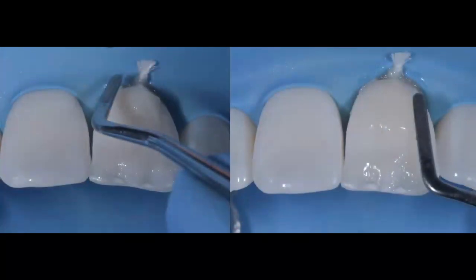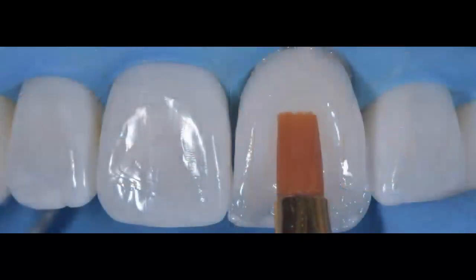Now I'm starting to build that composite, again going with that opaque composite on the cervical third. I'm literally using opaque bleach shade all throughout the restoration because she had a really high value enamel, very light teeth. She had bleached excessively, and that's something that you always have to be careful with when your patients are bleaching. Make sure that they don't bleach too much, because if it's too much, it's going to be really a tough time for you if you ever need to do a restoration. Like in this case, you're going to have a really tough time trying to match that shade. And we really had to look through different systems to try to find the right shade for this particular case.